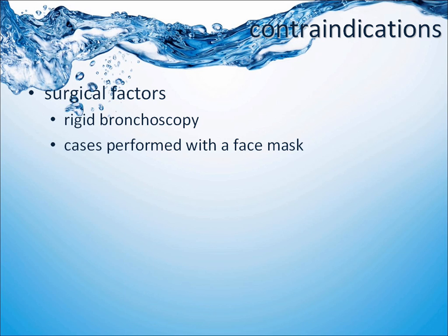There are some surgical procedures that this is not ideal for, such as your rigid bronch, where you've got a basically open system, and cases that are performed with a face mask, unless your medical student's really good at holding the mask down for you.